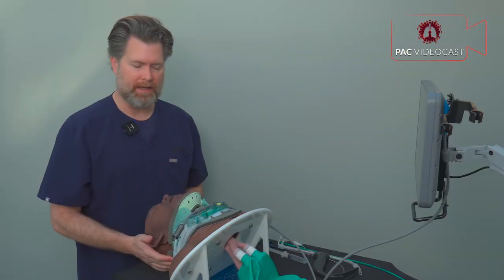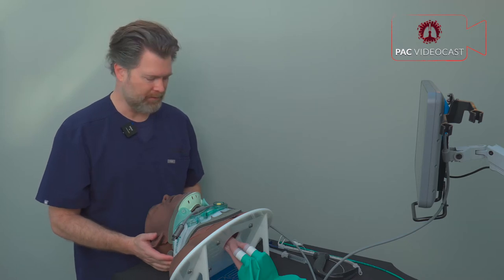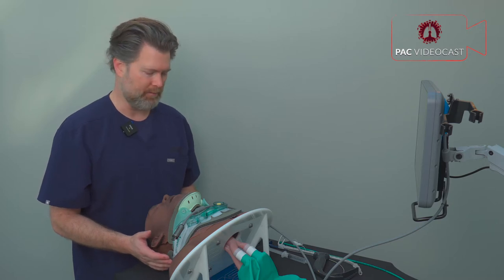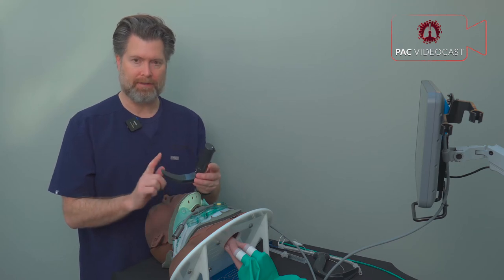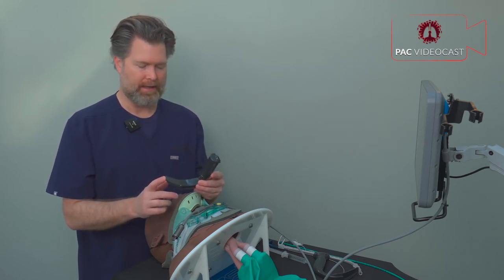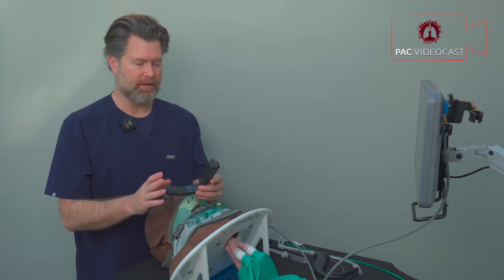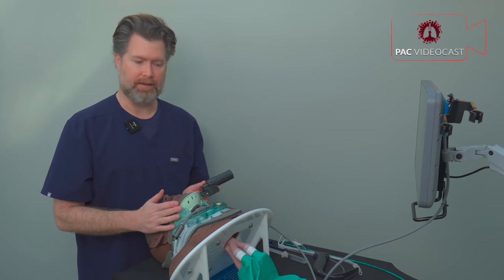Now let's intubate using the video laryngoscope, going through a couple of different blades with some pros and cons. The first blade is the GlideScope Mac3, a standard geometry blade — the one most people reach for in practice. We're going to see how it works not only with a stylet but also with a bougie, with the cervical collar in place.